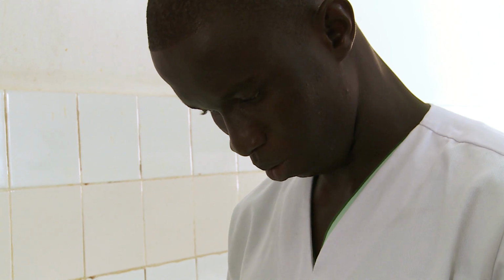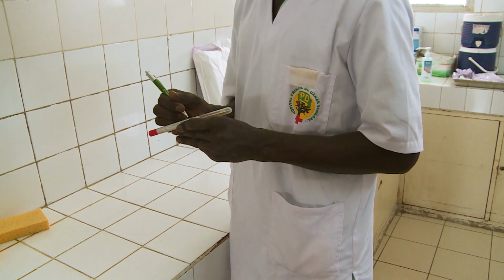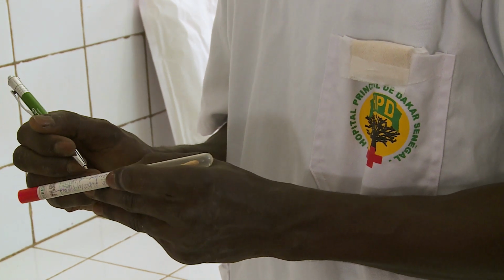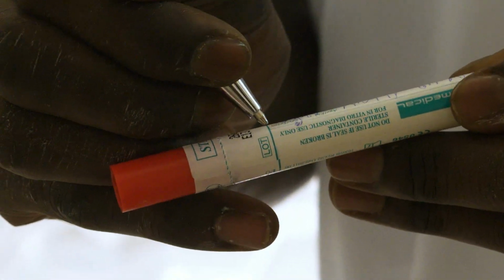If a sample was collected, ensure that it is correctly labeled and send it for analysis. If any breach in the aseptic technique or contamination of the outside of the swab pot occurred during sample collection, don non-sterile gloves or clean the outside before handling.